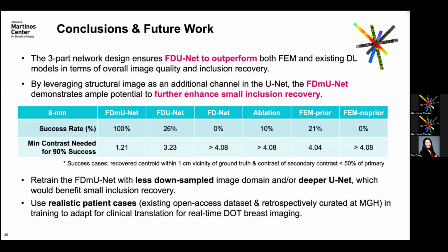And machine learning is good. One of the first successes of machine learning models is for segmentation. So we figure the model can learn where the suspicious place is, and then the optical measurement helps to offer information on whether the suspicious region has elevated HbT or not, to help with the diagnosis. So this way we don't need the radiologist input, so it's much more efficient.